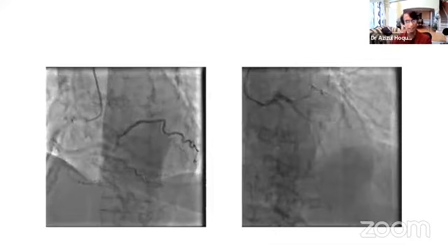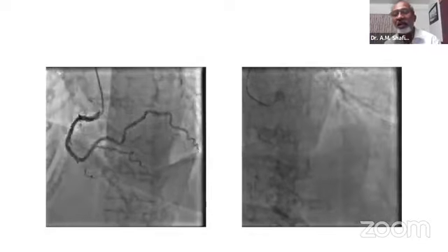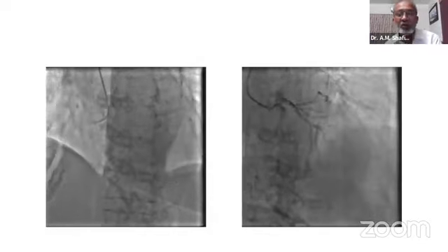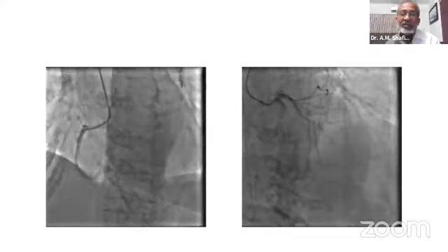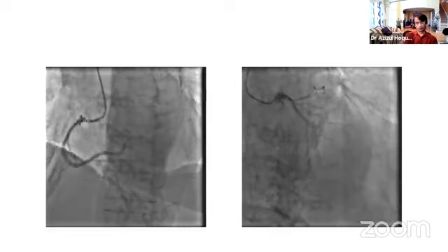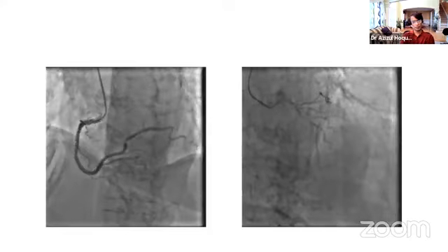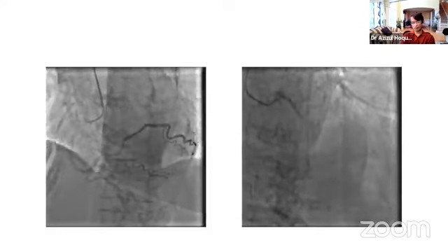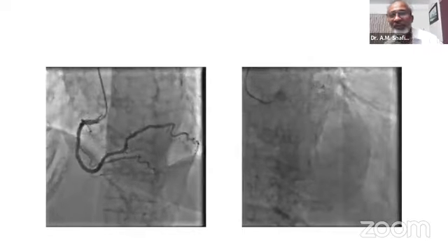That's interesting. What were the potassium and magnesium levels? That was normal. I checked that. Initially I thought this was hypokalemia and hypomagnesemia. It could be. Was he getting amiodarone? Not getting. But this cath looks like the patient has cardiomyopathy because I don't see the heart moving much, even with the fluoroscopy. No, I did the echocardiogram. I can show you the echocardiogram. No, it's okay. I believe you.